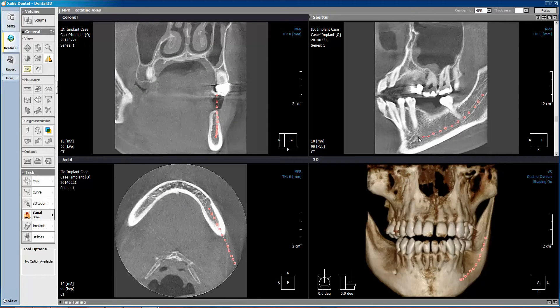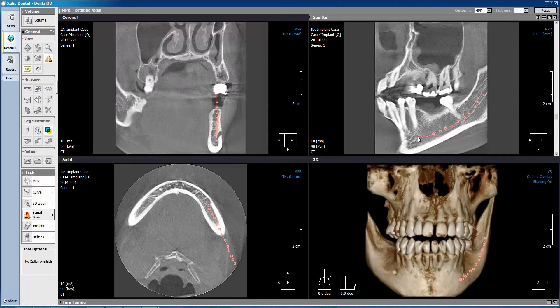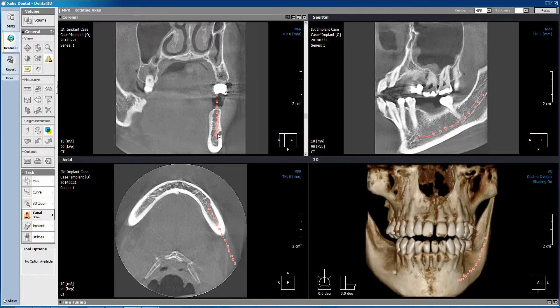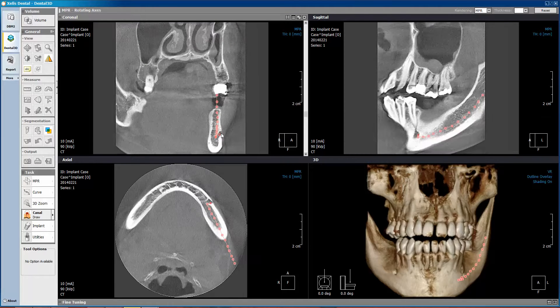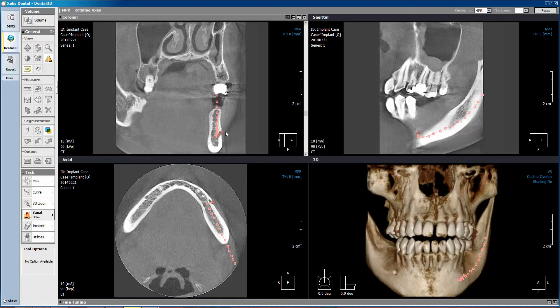As I get close to the mental foramen, I can move over to the coronal view, continue making single left mouse clicks, and double click when I'm done.